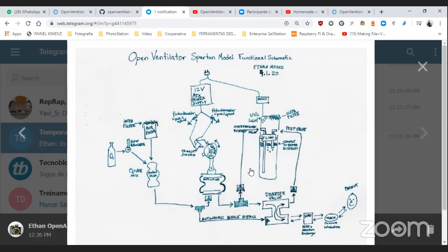That's why, for example, in the Spartan model we are using a simple end switch and a relay to have two speeds to adjust, or maybe three or four with some resistors. We can manually jack in a plug and jack out from one and another plug to have this kind of resolution between inspiration and expiration timing. For the frequency, we put a potentiometer to increase the voltage on the motor. With the Mark II version, that's the most important, that's why we are calling you from Arduino: we would need Arduinos and some kind of fancy sensors to solve that, but we won't have the problems of fancy valves. We can use solenoids and some kind of airflow meters and that kind of stuff.